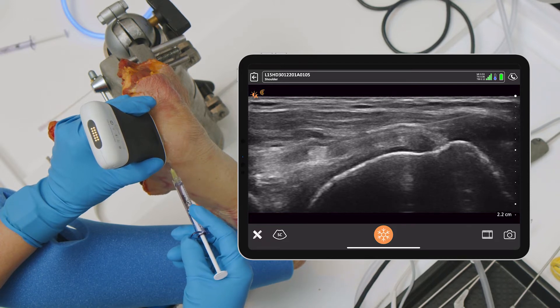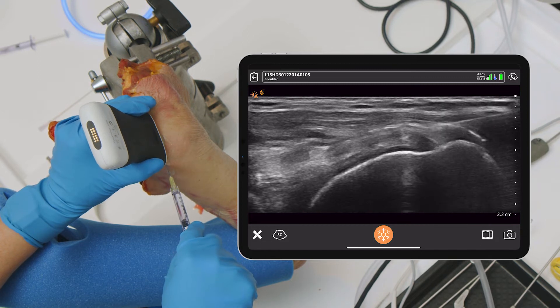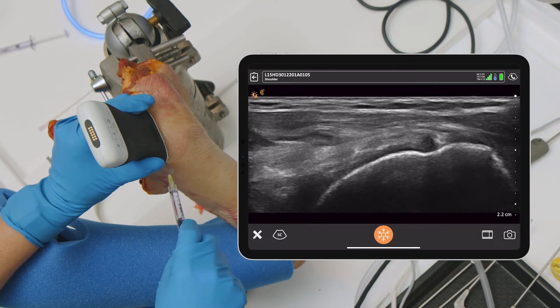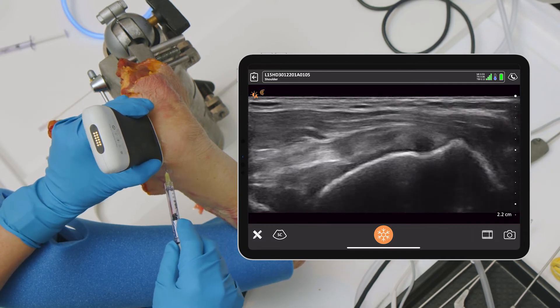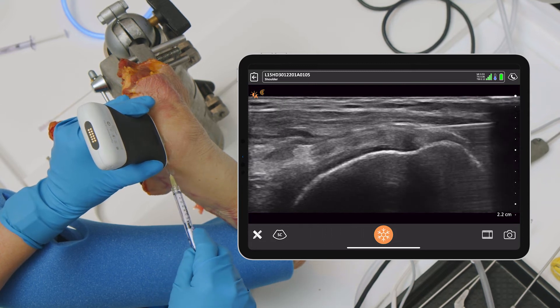If we're doing a PRP injection and we're more concerned about making sure we have actual injection into the tendon, we can reorient and actually go into the tendon — which you can't do with cortisone. That's not appropriate for cortisone, but going into the actual tendon itself — let me get a better image — and there you can see it.